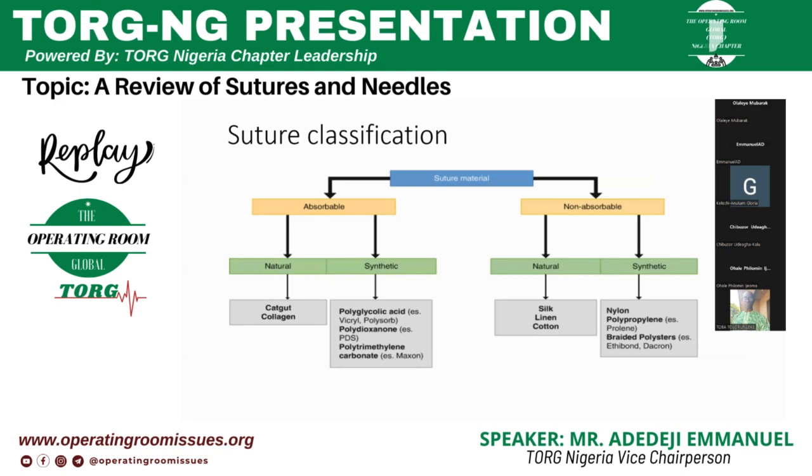Ethicon company actually made it in big commercial quantity. So now for most neurosurgeries, eye surgery, and vascular surgery, polypropylene is used because of its tensile strength and durability in the tissue. These are some of the things I feel I should share based on this topic. I wish we can have contributions from other members of this platform. Thank you, I'm waiting for comments.